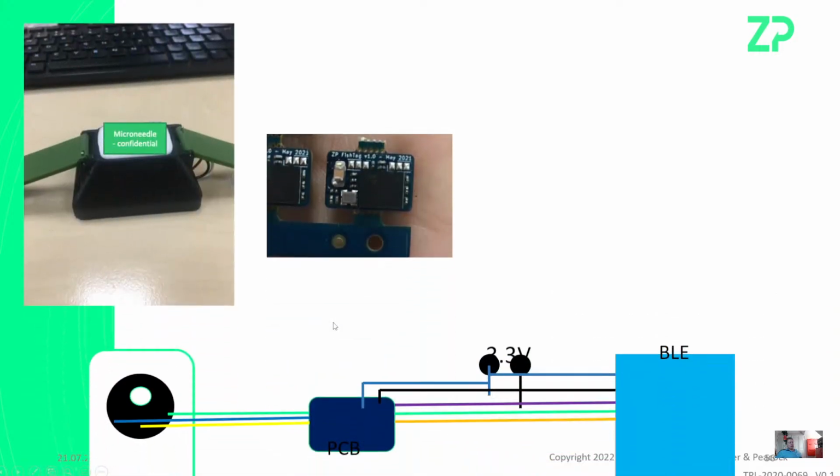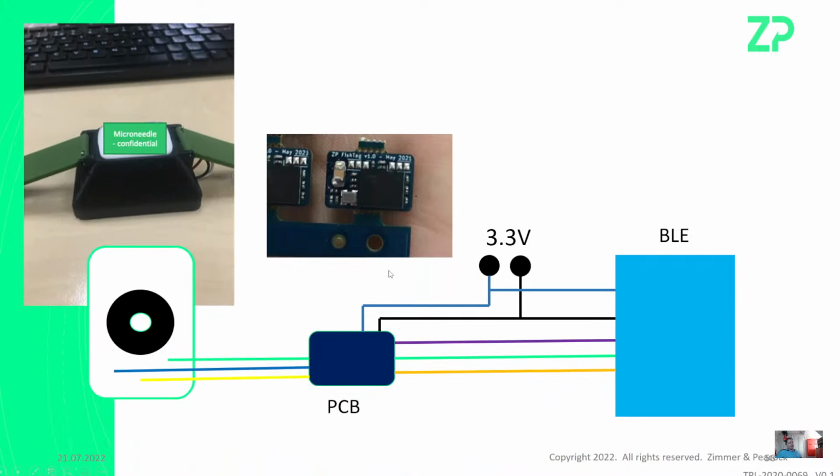So I'm just saying on this one, we have actually developed, just a quick reference here. If you're wondering how big the electronics required for a glucose meter are, this object, which will run a glucose sensor, but will also run this cortisol sensor, this is smaller than my thumbnail. So it's a very small object. We use the same electronics for essentially all of our sensors.